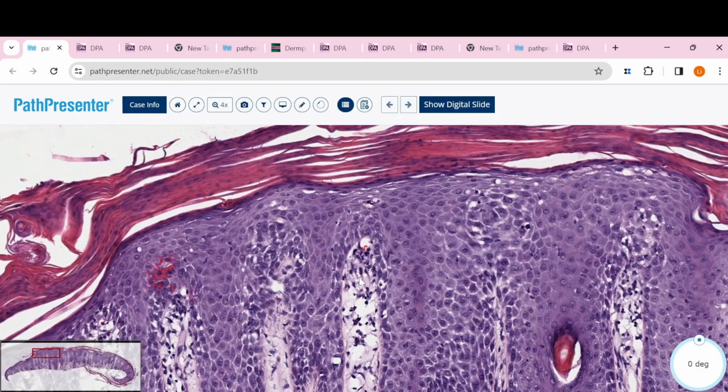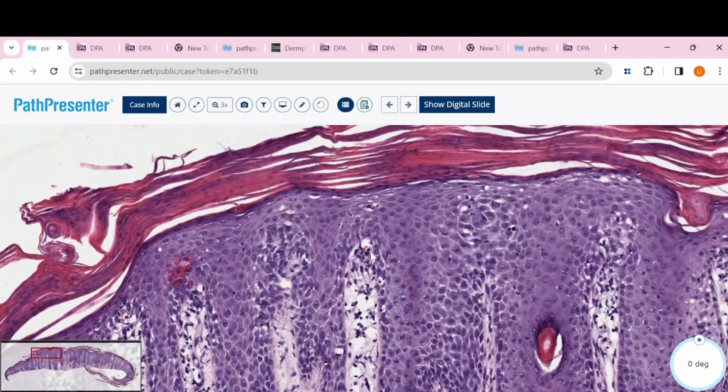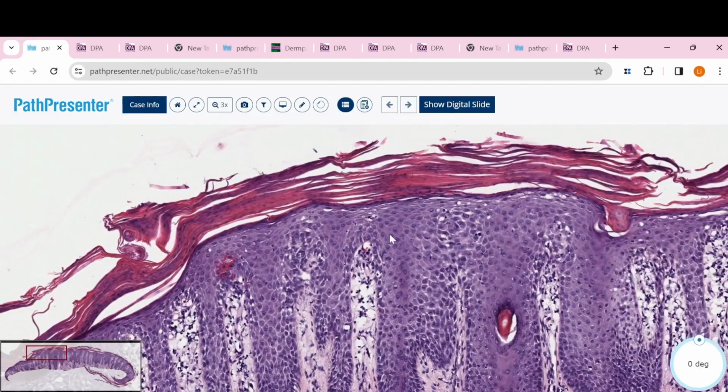So this makes you think of the clinic, when the dermatologist tries to scratch the plaque of this psoriatic lesion, you will easily see some blood, because when you take something out, it's really easy to break this vessel. So all of these features are psoriasis. I think the most important thing is the parakeratosis and the neutrophils inside the parakeratosis.